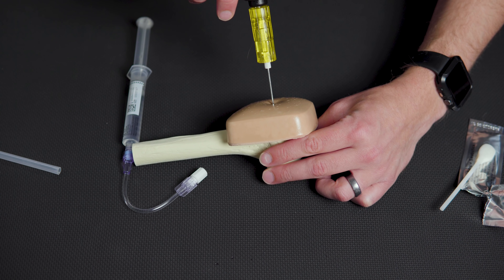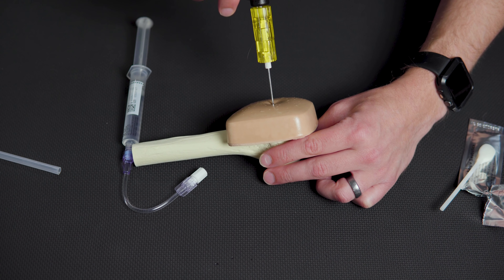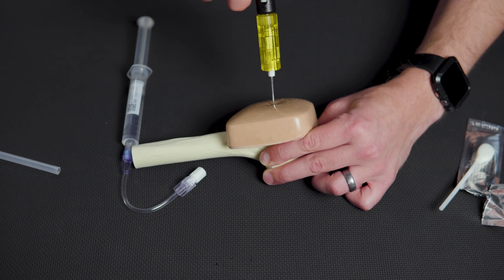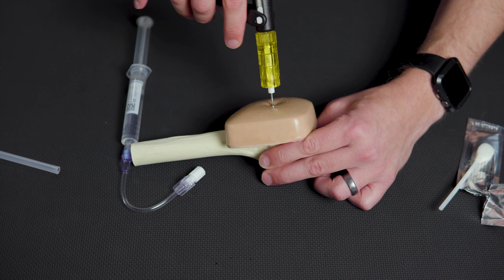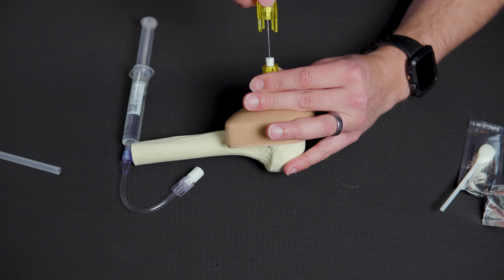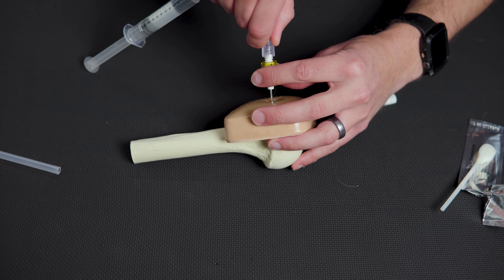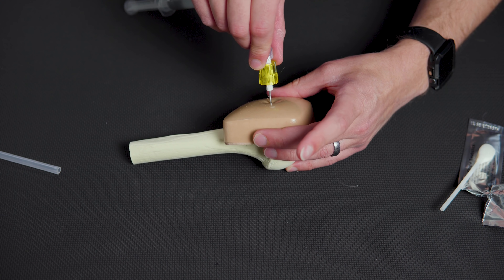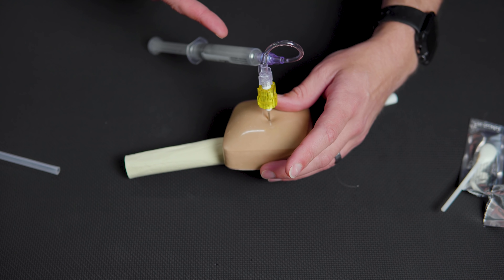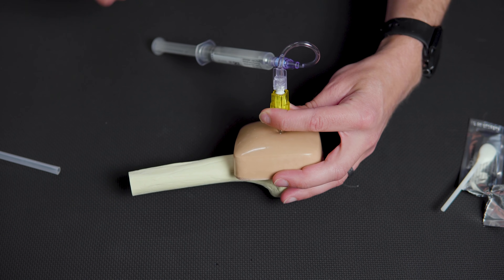Apply gentle downward pressure — most of the penetrating ability comes from the twisting motion, not downward pressure. Actuate the device and go until you feel a small give through the bone. Once you feel that give and it sinks slightly, stop — don't bury it to the hub or you might go through the other end of the bone. Then disconnect the driver hub, leaving the hollow bore needle in place. Connect your extension loop to the luer lock. You can tell it's properly in place because it will be relatively stable — if it's only in tissue, it will be wobbly. You can aspirate blood and marrow for lab studies, but inability to aspirate does not mean it's misplaced.